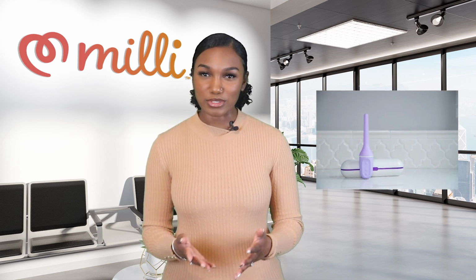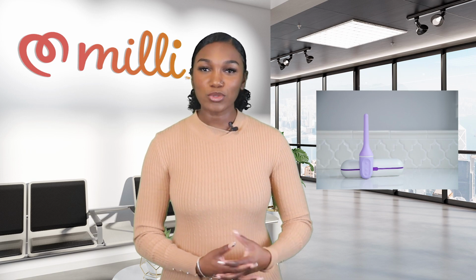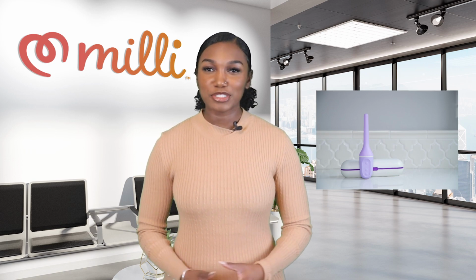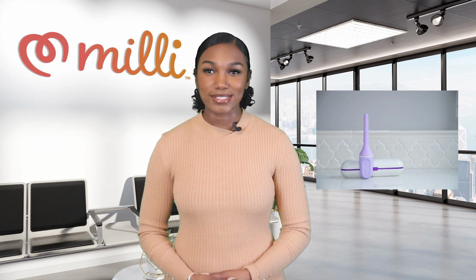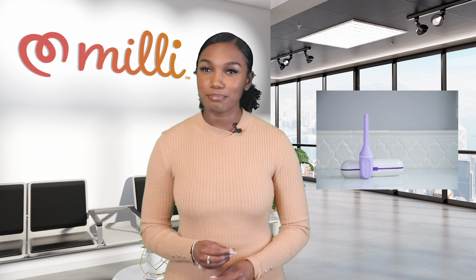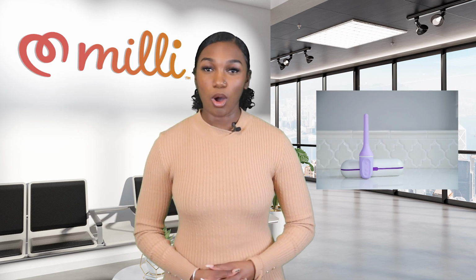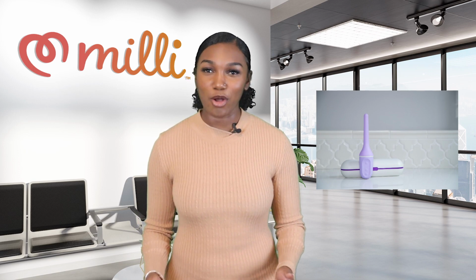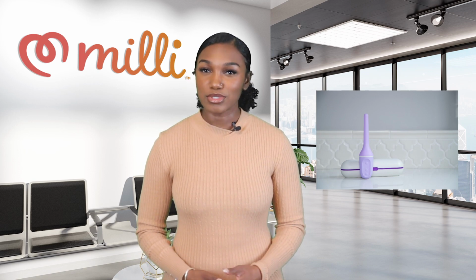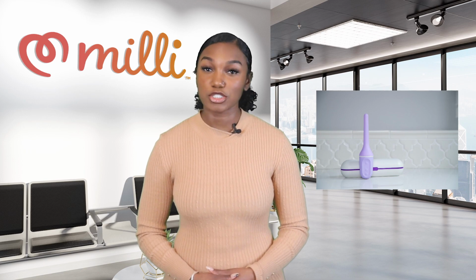Please note that Milli is for single patient use only and should only be used in the vagina. We recommend you clean Milli prior to the first use and after each use. The device is not waterproofed, so it should not be submerged in water. Wash the wand, the expanding part, with mild soap and water and wipe down the handle with a damp cloth. Do not wash Milli with harsh products such as alcohol.